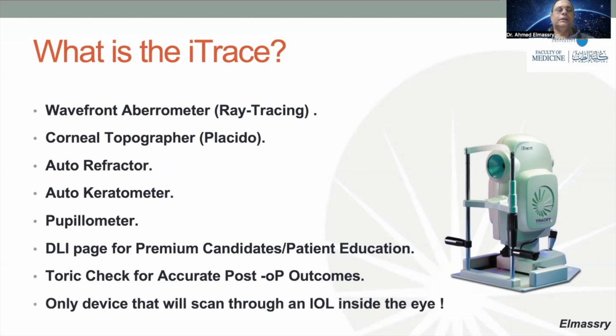It is the only device that will scan through an IOL inside the eye.